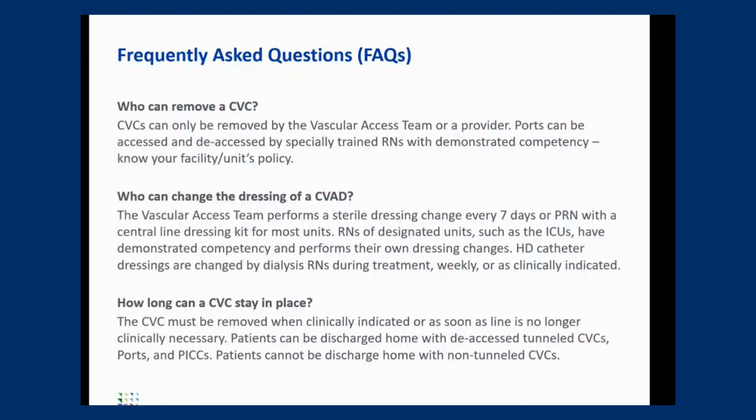And a central line, how long can it stay in place? Well, we try to keep them for the shortest period of time that's required for treatment for the patients, because of course, the longer you keep central lines, the greater your risk for infection.